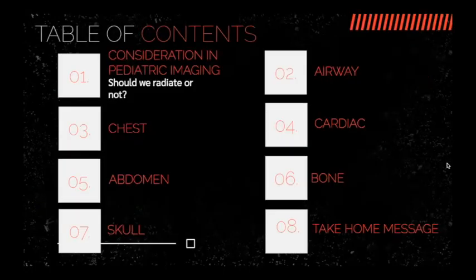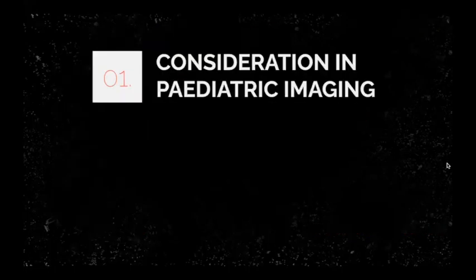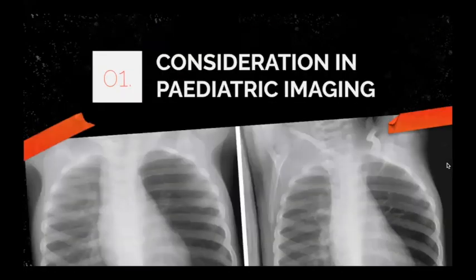First of all, we are going to go a little bit on the considerations in pediatric imaging, and then we go through all the systems, and then before we end, there will be a little bit of a take-home message. All right, considerations in pediatric imaging.